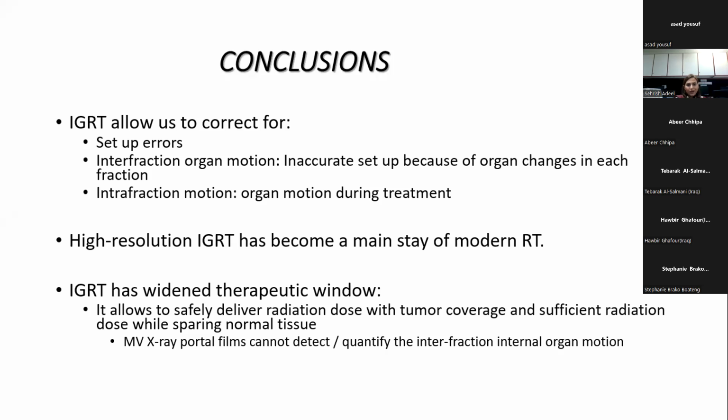IGRT. IGRT has widened the therapeutic window. It helps us to improve the local control by delivering the precise treatment to the patient.